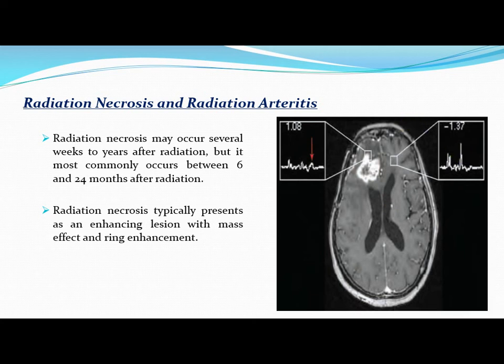And on follow-up MRI, the recurrent tumor will be larger. Yes.